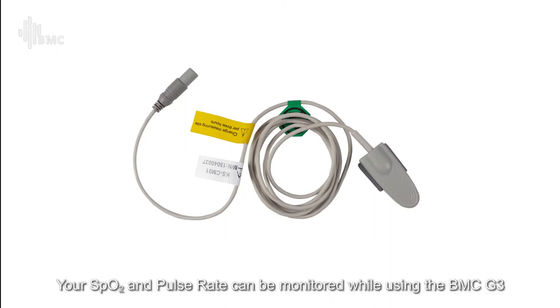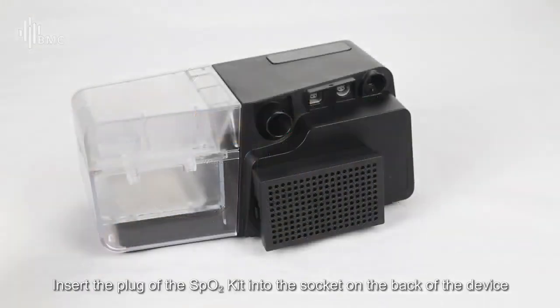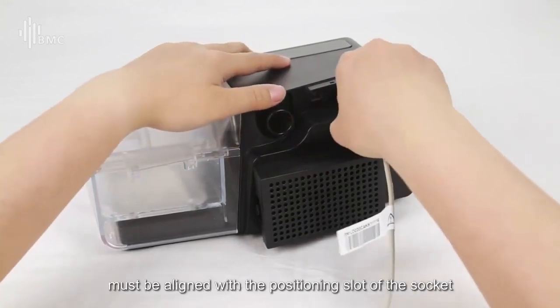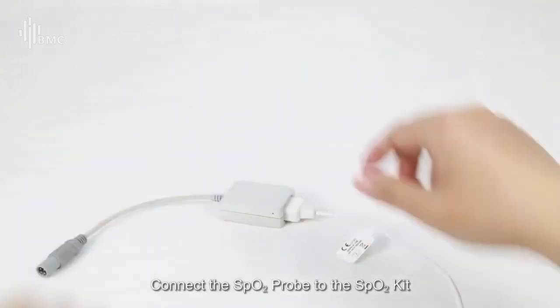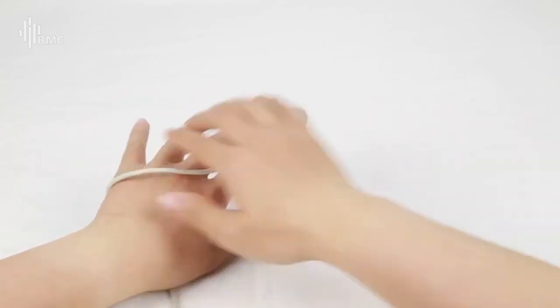SpO2 kit. Your SpO2 and pulse rate can be monitored while using the BMC G3. This allows you and your care team to monitor any health changes. Insert the plug of the SpO2 kit into the socket on the back of the device. Note that the positioning slot of the plug must be aligned with the positioning slot of the socket. Connect the SpO2 probe to the SpO2 kit and then wear the SpO2 probe on your finger while using the device.